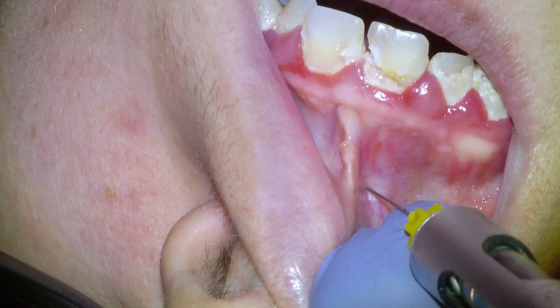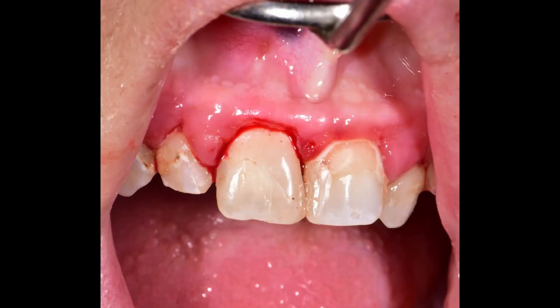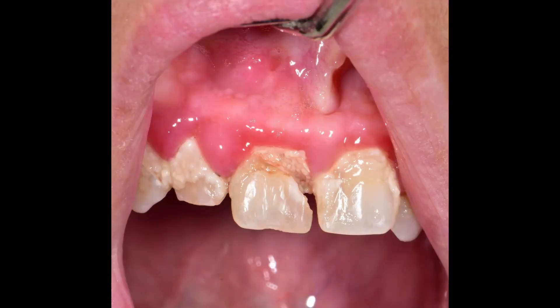Hi everyone, Dr. Tanner Dobson, and in this video we're going to be doing a root canal. This is a patient that came in with a large cavity on their front tooth that was well into the nerve, and we fixed it with the root canal and a filling. So there's our final result and in this video we're going to be going over that procedure.